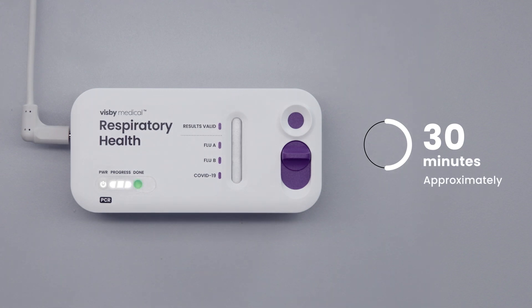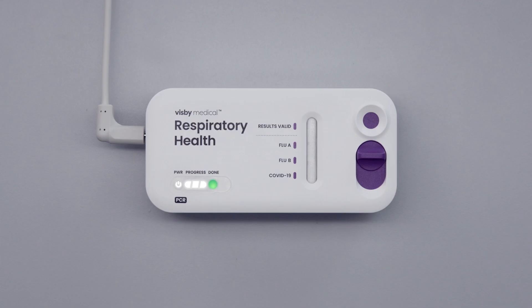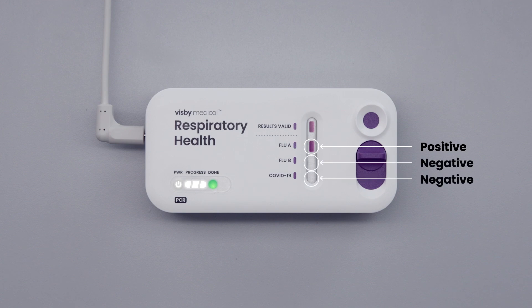The results are ready when the green light appears. Once the test is complete, a purple spot next to 'results valid' along with the green light indicates the test is valid. If the test is valid, any shade of purple with distinct edges is considered a spot. The intensity of purple may vary. For this example, the sample is positive for flu A and negative for both flu B and COVID-19.